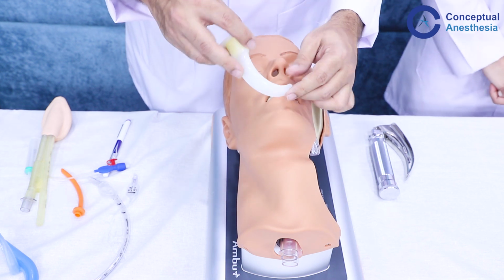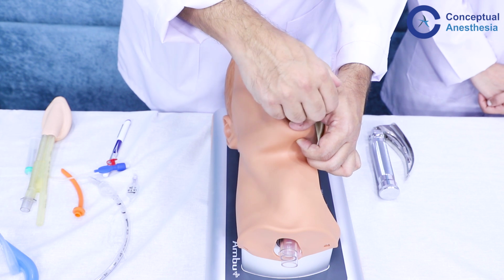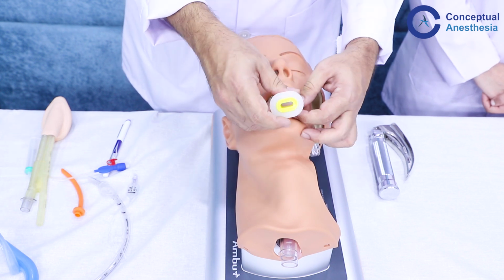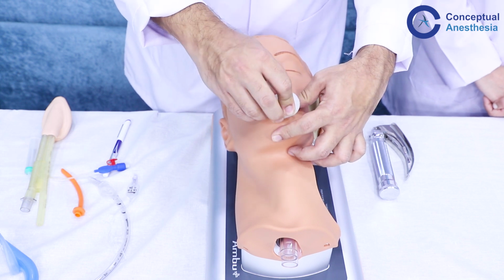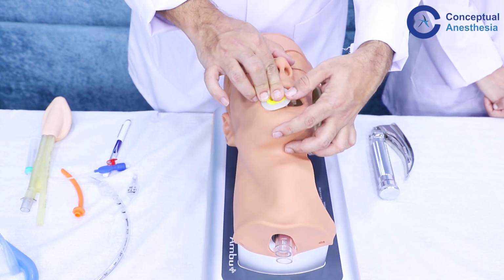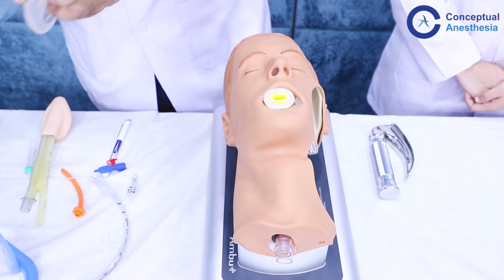Now we will introduce the oropharyngeal airway. There are 2 techniques to do this. First, you put the airway and then rotate it and then push it inside. Yes. And then we ventilate the patient.